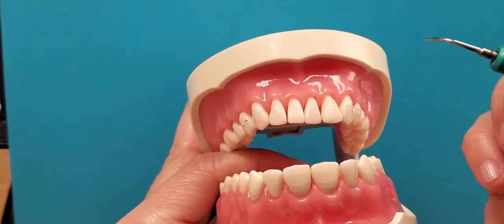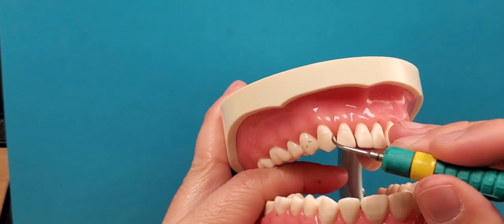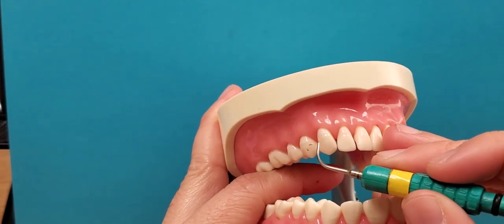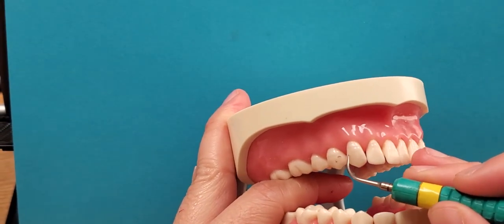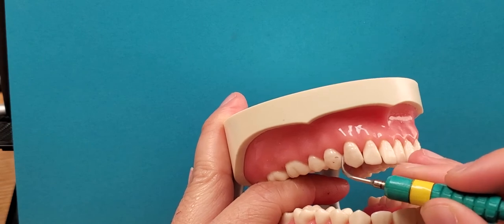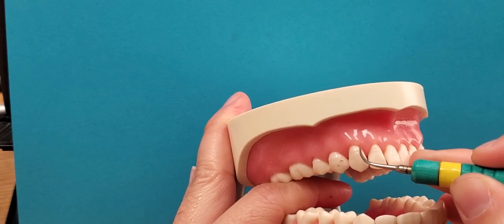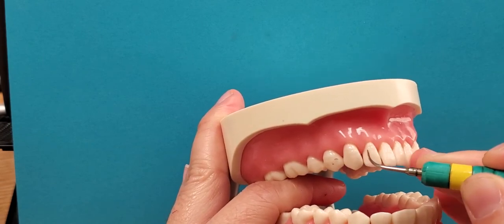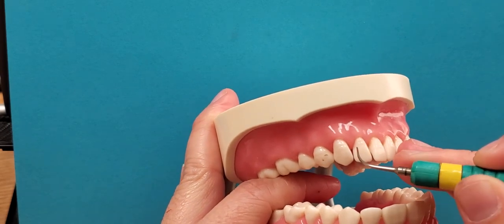My recommendation for beginning ultrasonic instrumentation is to do probe style throughout the sextant that you're working on. Remove everything that you can with probe style.